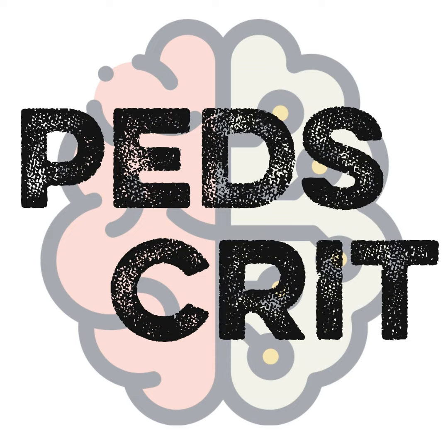And then what happens if the patient is improving? And this is real life. For example, in the middle of the night, I get a call from the fellow or the resident: I have this patient on the oscillator, it's now day 3, seems to improve a little bit, but the patient is becoming more and more hypercapnic. I've already decreased the frequency, but nothing happens. And then I say, okay, reduce pressure and call me back in 30 minutes. They call me back in 30 minutes and say, oh, the CO2 has dropped and it's really going well. Then I explain to them, the patient is improving, compliance is improving, so you get more lung volume with that same mean airway pressure. And with a bigger lung aeration, you will get overdistension at some point and compression of the capillaries, resulting in hypercapnia. So that's something that people really need to understand.